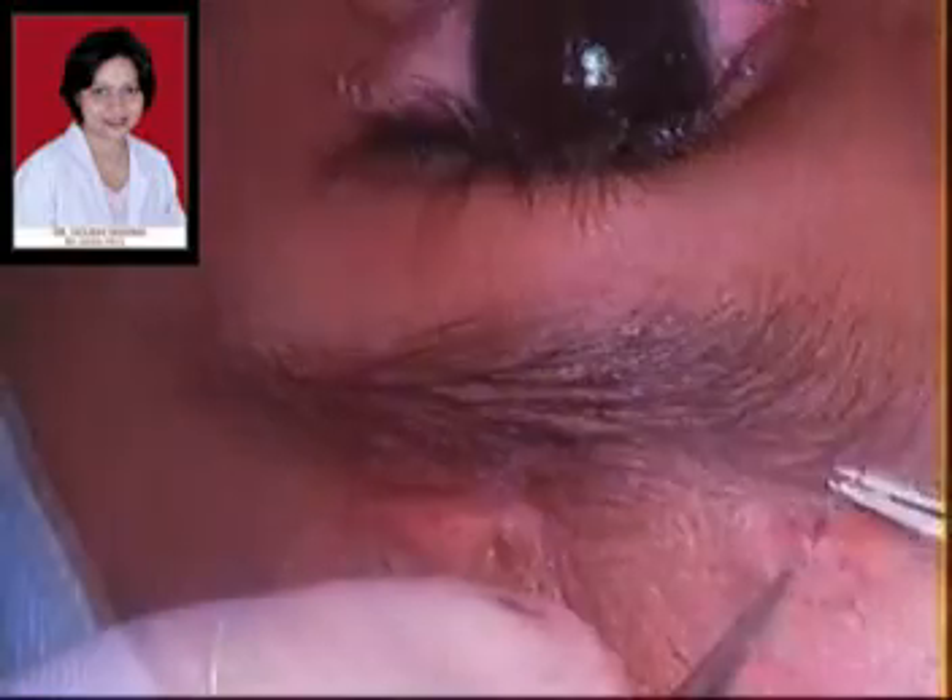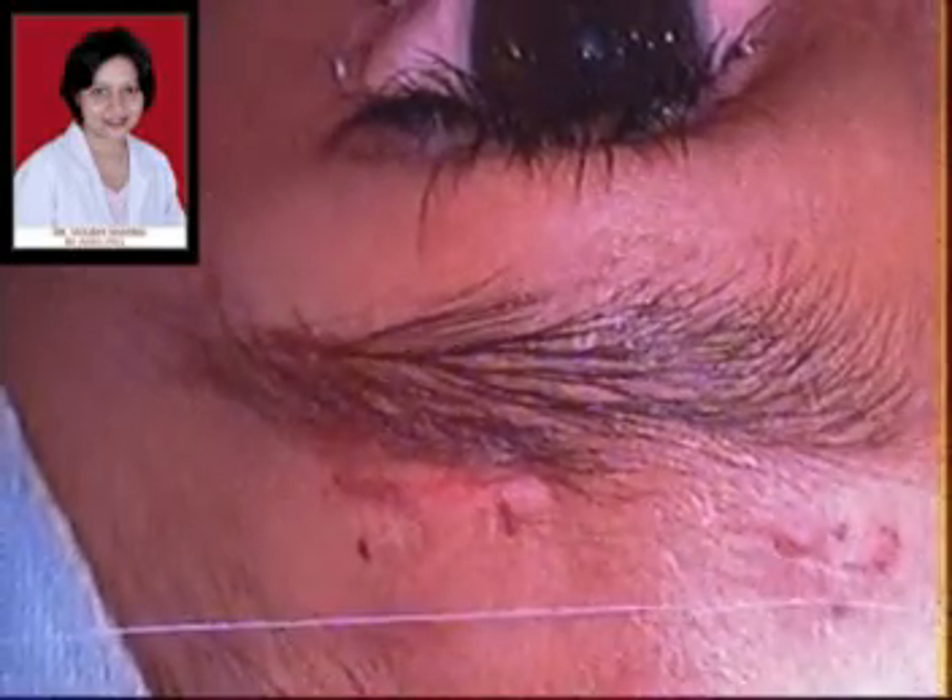The knots are then well buried and the incisions above the brow are closed with 6-0 vicryl. The incisions on the eyelid need not be closed as they will heal on their own. As you can see here, this is the appearance of the child after surgery. Note that the height of the eyelid is very good and the lid crease is quite normal.